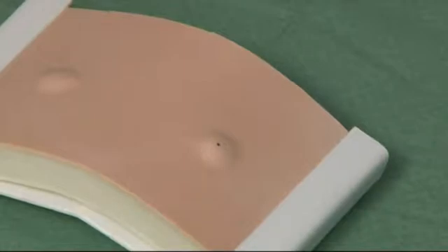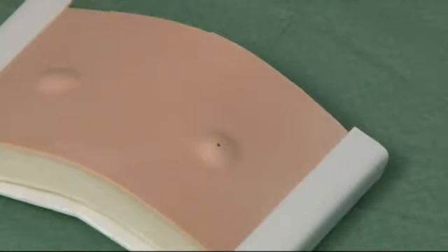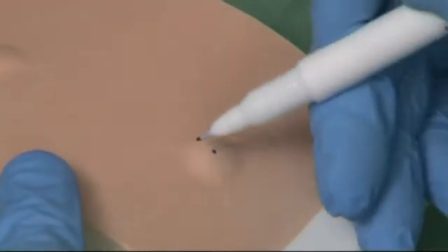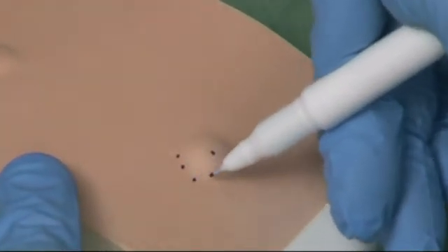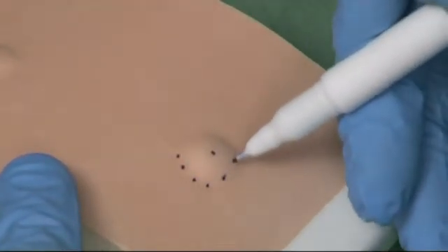We're now going to show how to excise an epidermal cyst. The cyst boundary should be identified and marked, and an ellipse should be marked out to include the punctum at the centre.